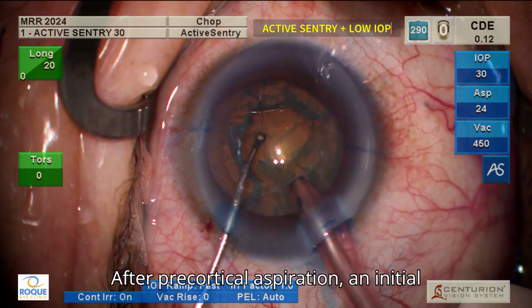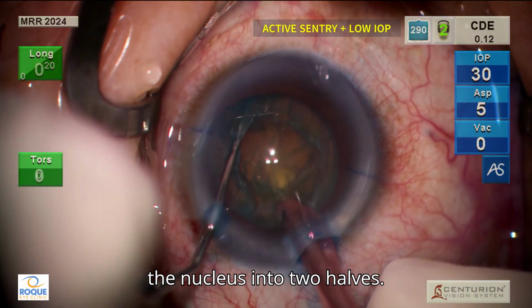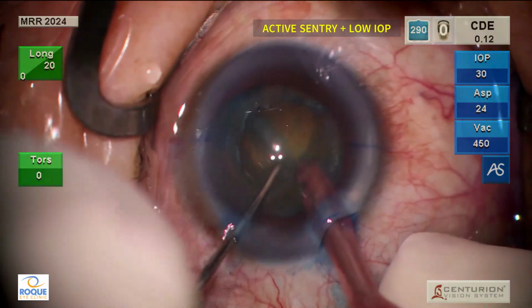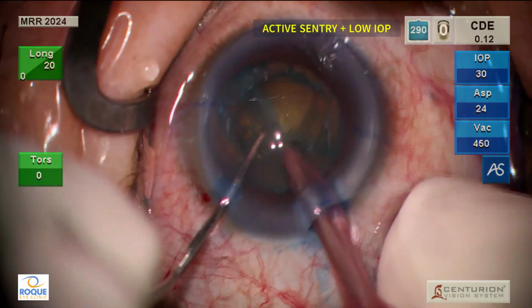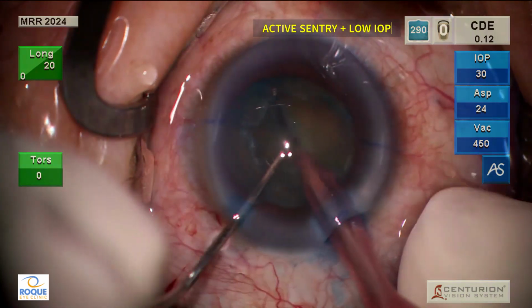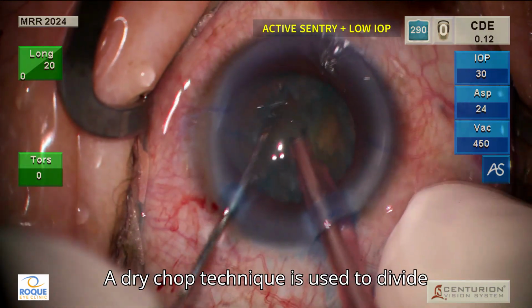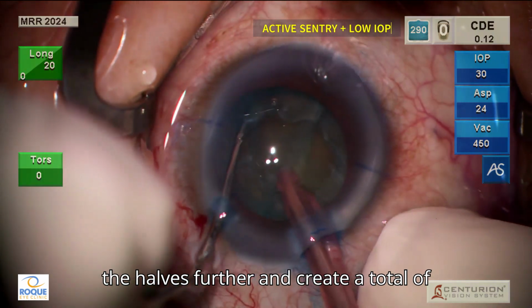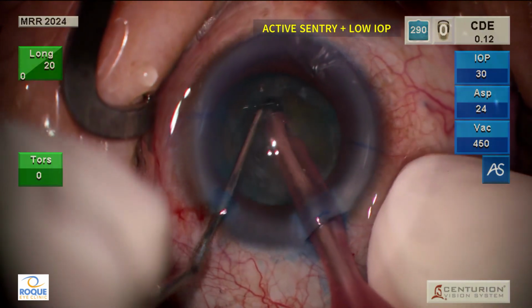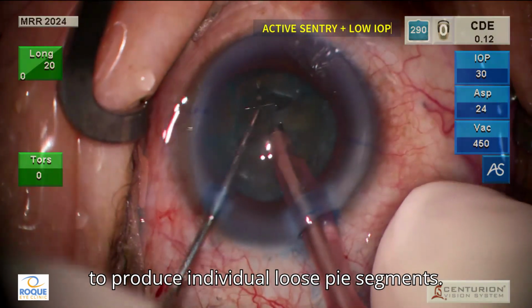After precortical aspiration, an initial horizontal chop is performed to divide the nucleus into two halves. A dry chop technique is used to divide the halves further and create a total of 6 pies. It is important to create a complete chop to produce individual loose pie segments.